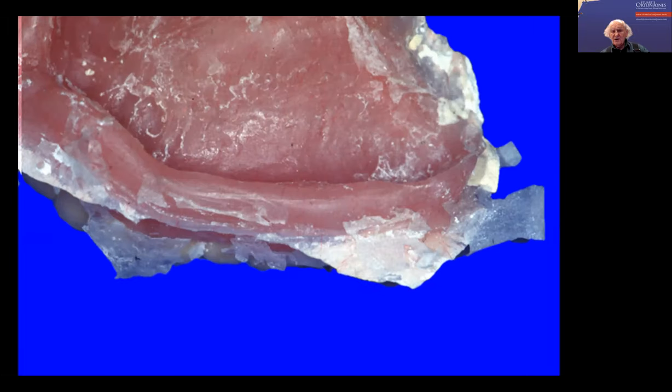Now here is where you need to make sure that the technician doesn't thin this, because you've gone to a lot of trouble to get this fold here, which is going to produce the retention. Eldo, do you get your technician to protect this area here? Do you draw a line on the model? I don't draw a line on the model, but by experience he knows what to do.